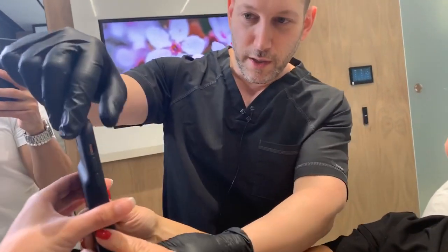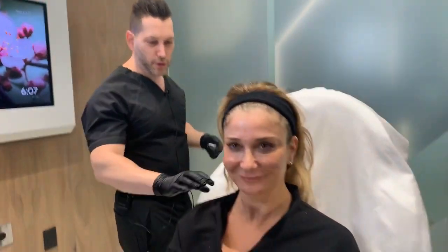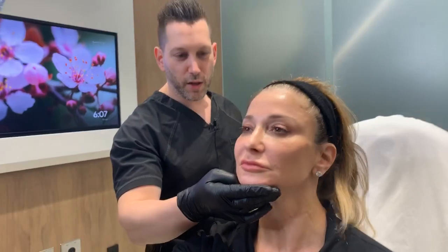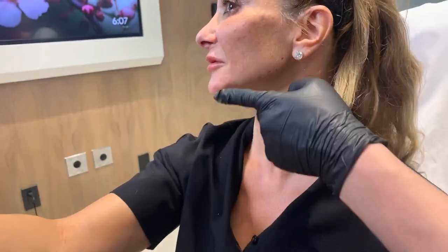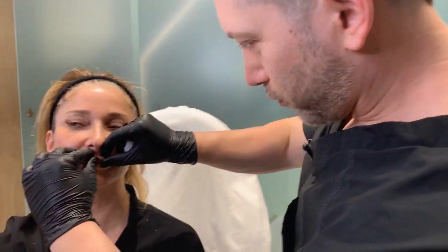Yep. So lift up, and now what I want to do is we're going to flip that back. Go ahead and give her a mirror. Let's show her how she looks in the mirror. Stand up straight, always up from above, chin up. Take a look at your jawline, nice and slow. What do you think? I love it. So this is lifting and contouring, defining the jawline, softening here, which we're gonna Q-tip a little more, definition in temple, and softening all throughout. So it's gonna look natural, great. It all looks subtle, it looks natural, beautiful lips.